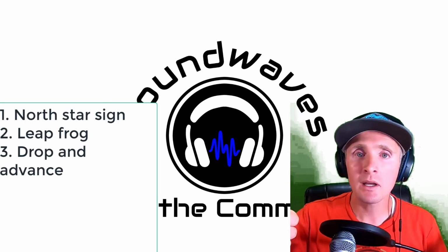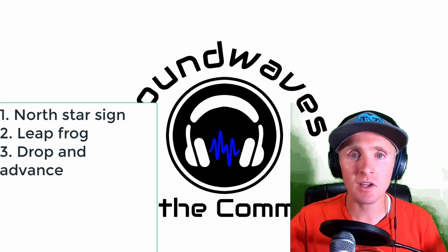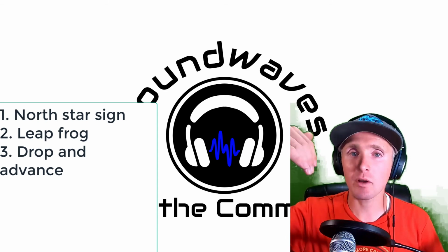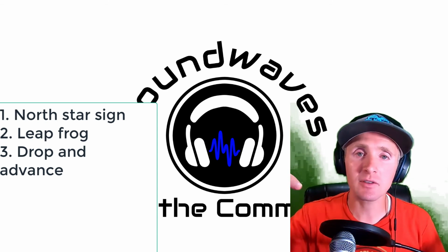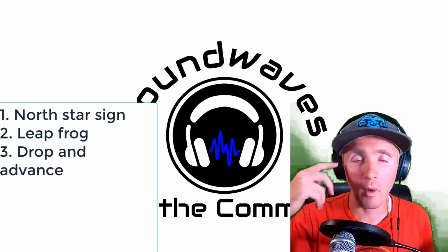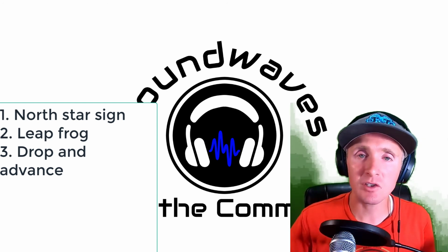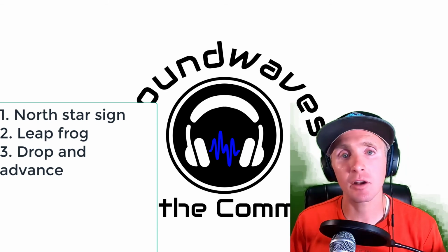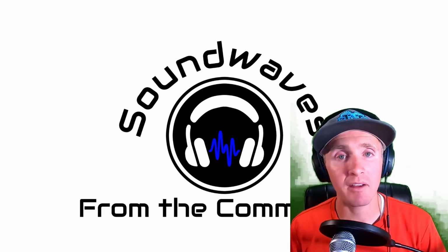So step 1, center your needle over your target with the North Star sign. Step 2, you want to leapfrog. Keep that sound wave plane just in front of the needle tip. So as soon as you hit the needle into the plane, you move the probe away from you, leapfrog until you get into the vessel. Once you're in the vessel, drop and advance. And that's how you're going to be able to be most successful with IVs.